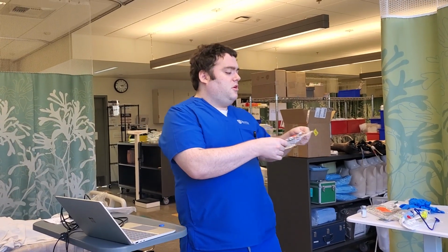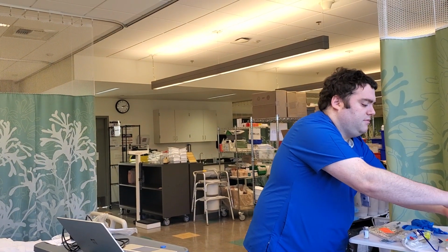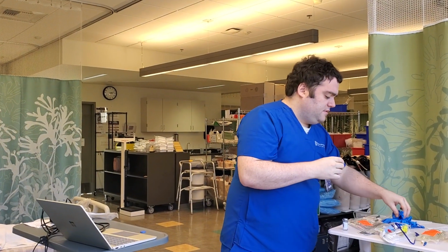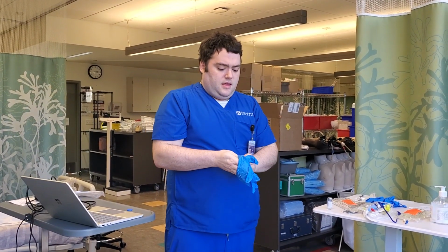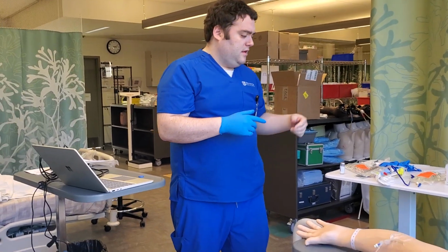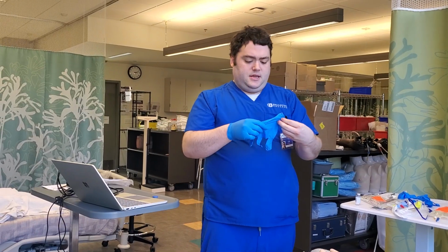So now I will first do more hand hygiene and put on some gloves. Again, I'm not sure if I mentioned it, we need to compare to the MAR.